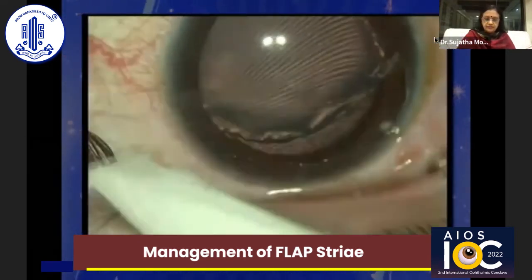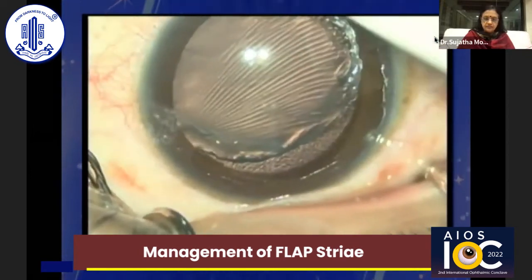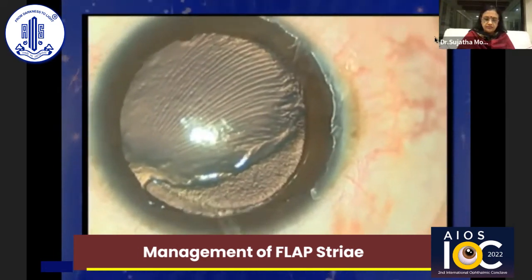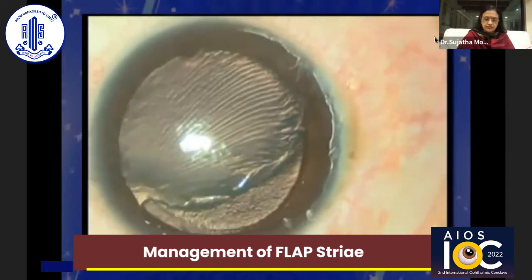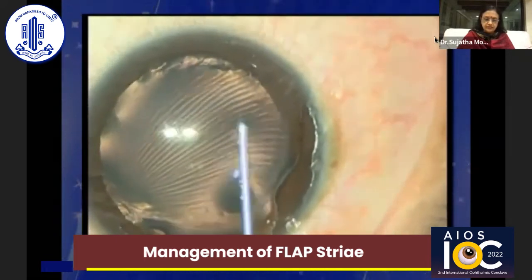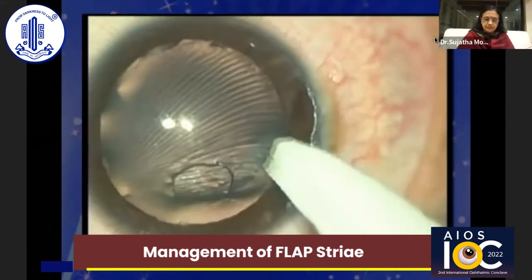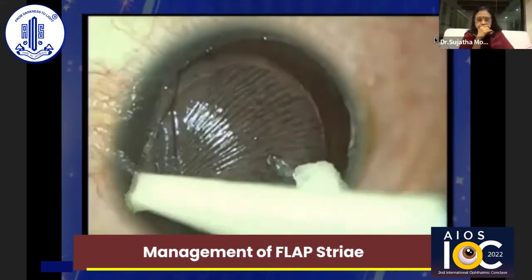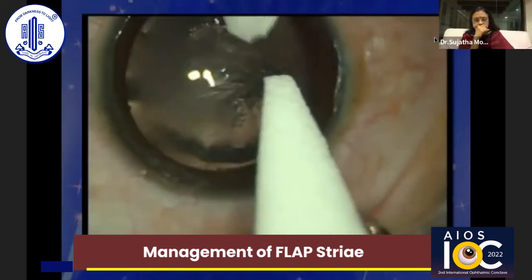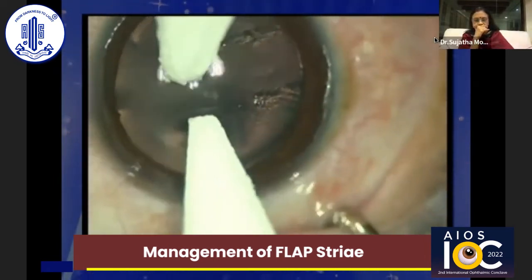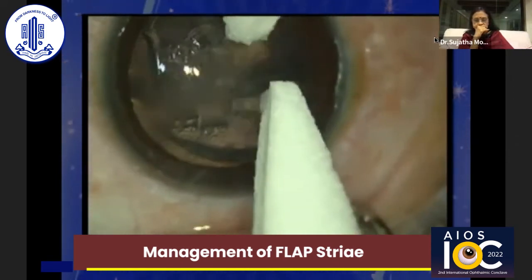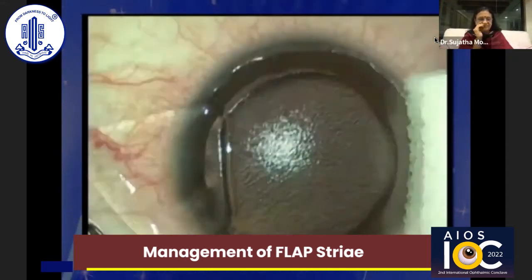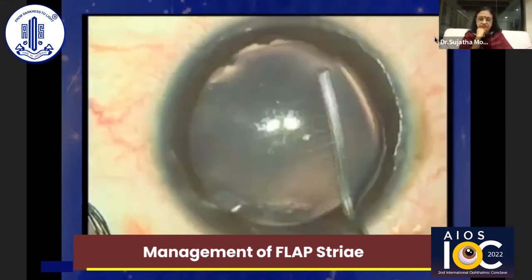The third case shows a similar situation with flap slippage, dense flap folds, and epithelial ingrowth. A Merocel sponge is used to completely remove all epithelium on the exposed stromal surface and a 2 mm margin around the flap. The flap is floated into position, the epithelium on the surface is also removed to facilitate removal of striae. Stretching the striae is done using two dry Merocel sponges perpendicular to the direction of the striae, and the flap is replaced after completely washing the interface.